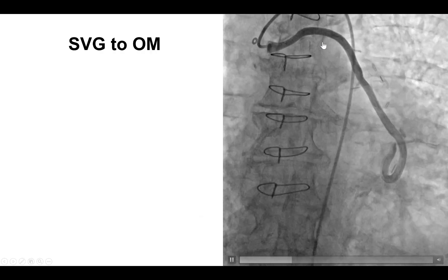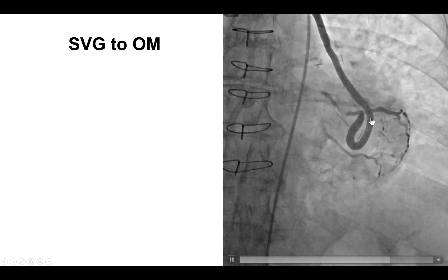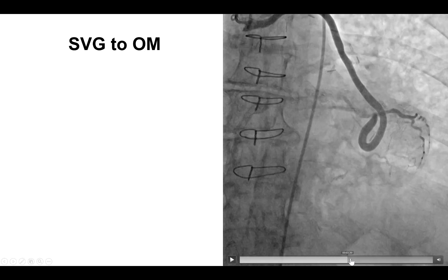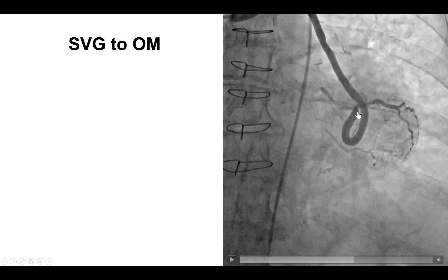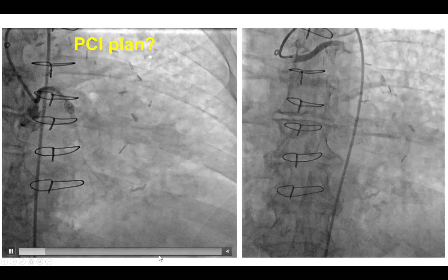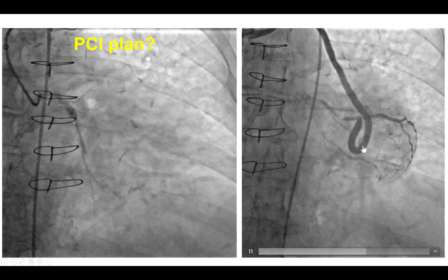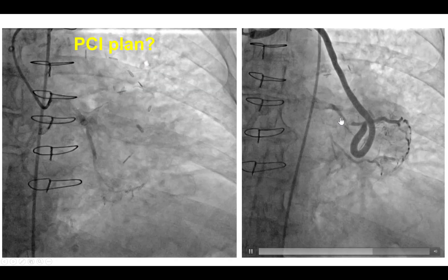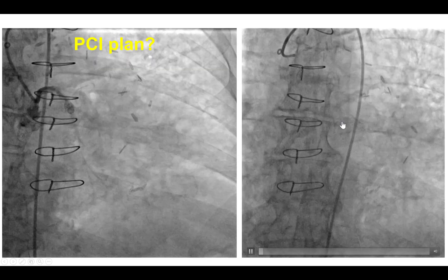The vein graft to the first obtuse marginal branch was actually patent; however, there was a significant lesion immediately proximal to the touchdown of the saphenous vein graft. So the patent saphenous vein graft was supplying OM1, with a severe lesion proximal to the touchdown, and the second OM getting intermittent flow both retrograde through the SVG and also antegrade. This appears to be the culprit lesion of the proximal part of the obtuse marginal branch.